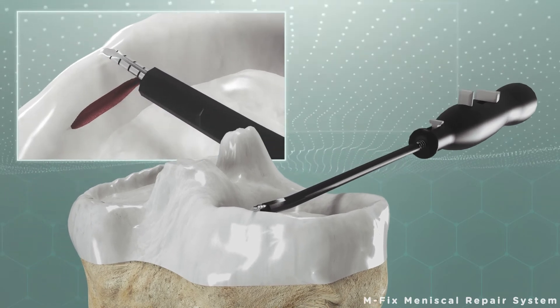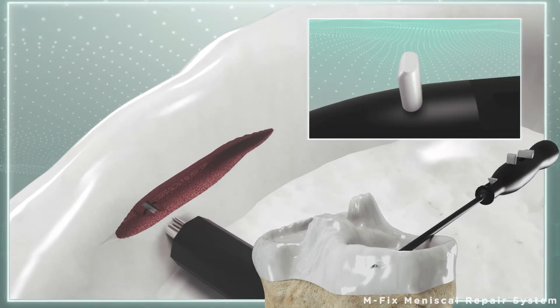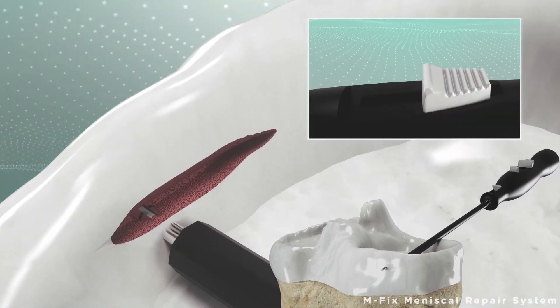The implants cannot be placed until the security button is clicked. After clicking the button once, the first implant can be placed.